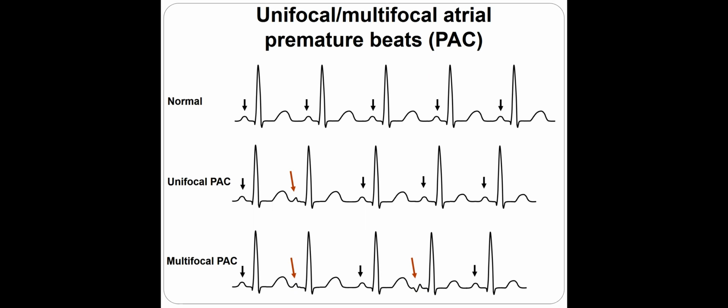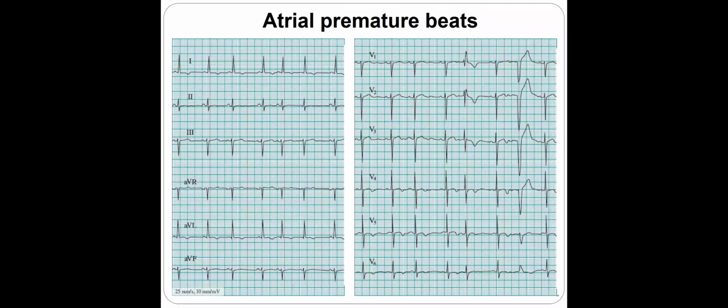If you have two at the same time, that can be couplets or triplets, or salvos. If you speed up, later on I will show you, but now let's go to this one.